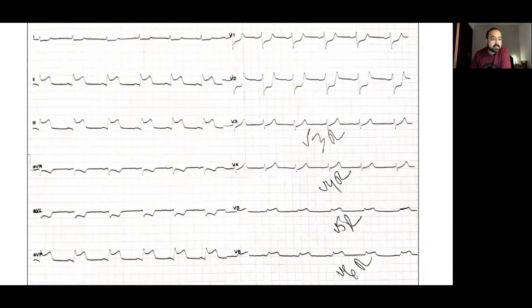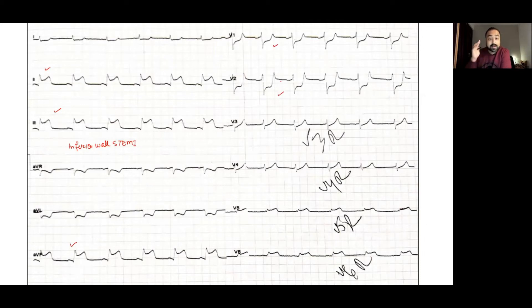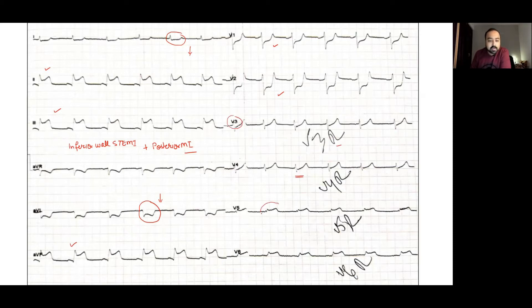In the next example, ST elevations are seen in the inferior leads: lead 2, lead 3, and lead AVF — indicating an inferior wall STEMI. In addition, there are ST depressions in leads V1 and V2, suggesting involvement of the posterior wall. There are also reciprocal ST depressions in leads 1 and AVL. Right-sided leads were obtained; while V4R shows no clear ST elevation, V5R and V6R show some ST elevations, suggesting possible right ventricular myocardial infarction.